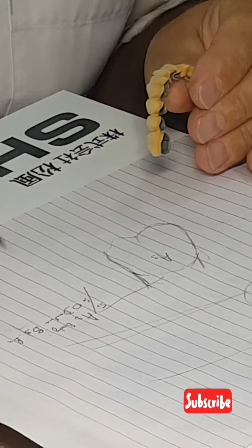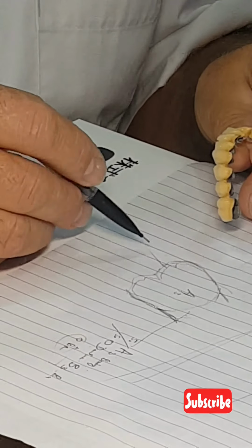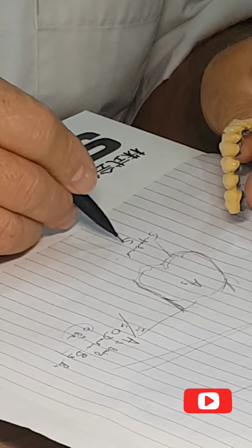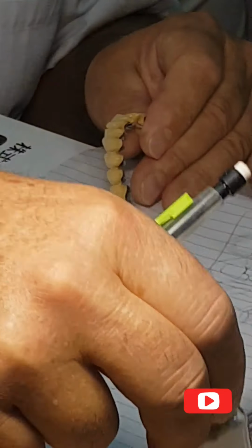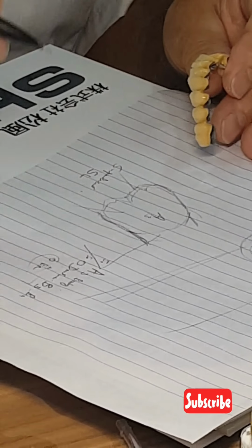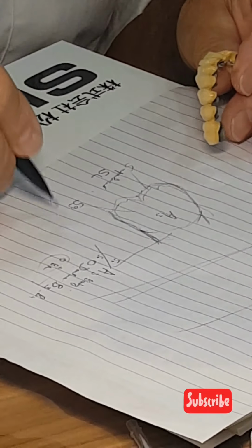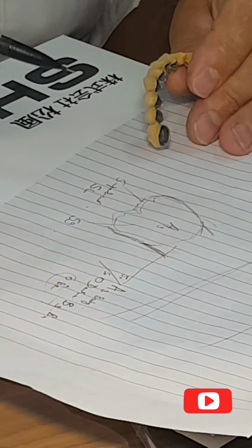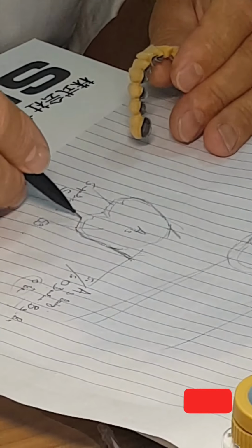A2, what I have to do now for my translucency, superlucent, SL. It's an incredible product to have a bluish, whitish color, and I will overbuild back with 71. Exercise. If we want, I show you a maximum of things.